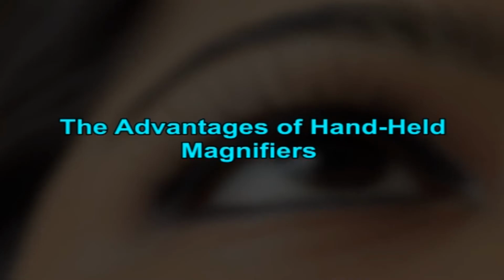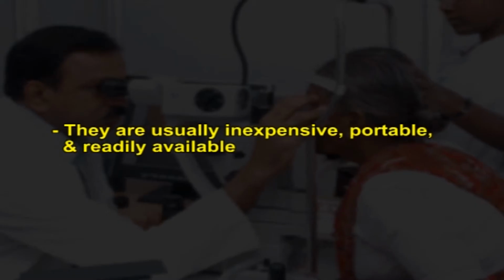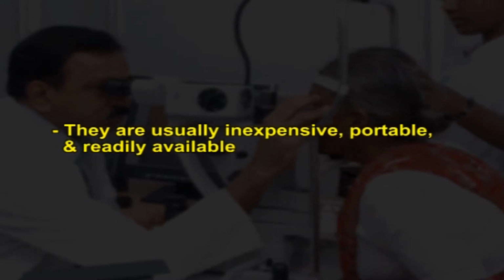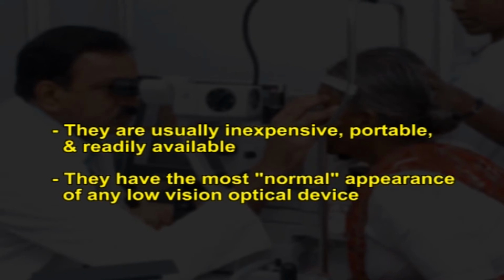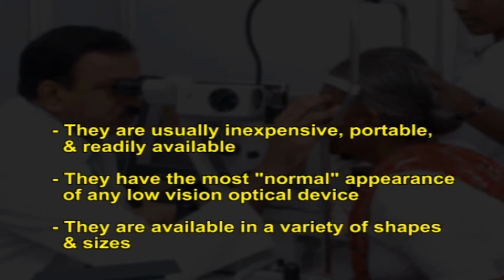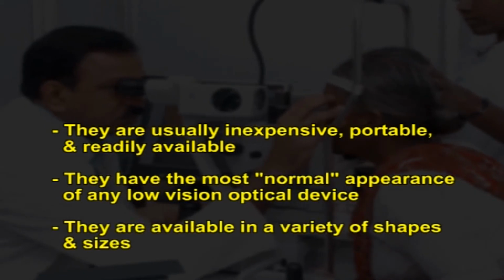The advantages of handheld magnifiers are, they are usually inexpensive, portable and readily available. They have the most normal appearance of any other low vision optical device. They are available in a variety of shapes and sizes.